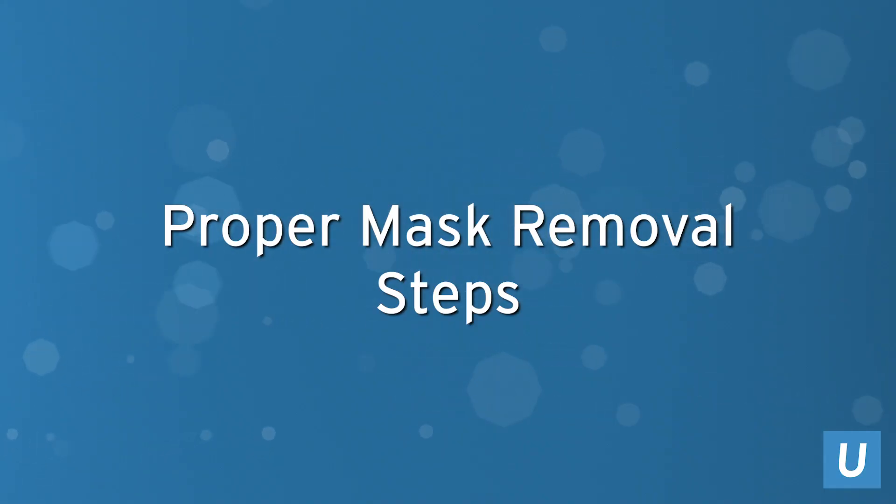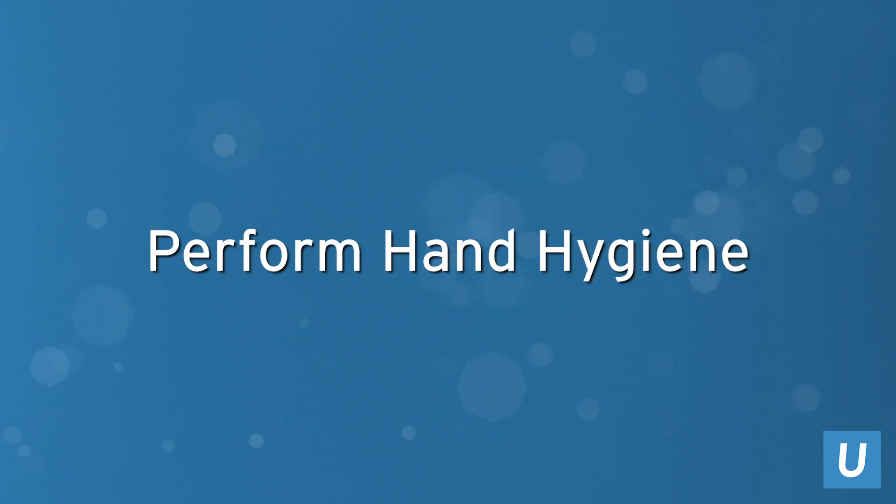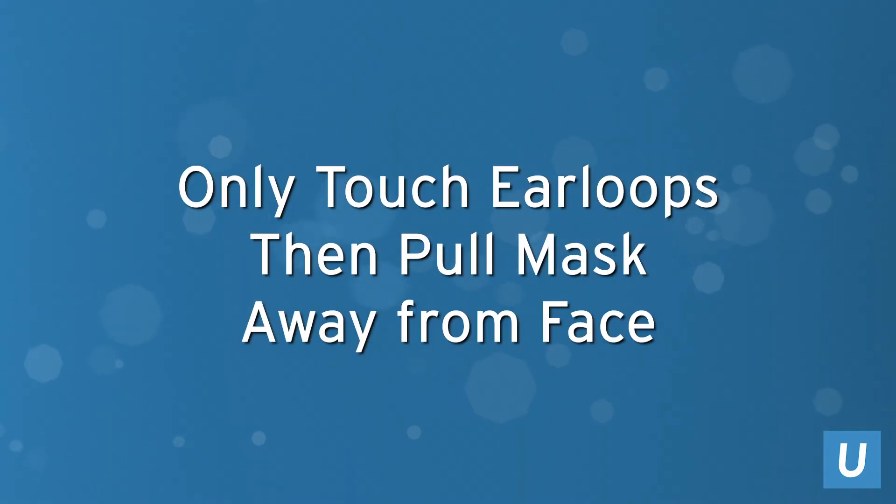If you need to remove your mask, you should completely remove it using the following steps. Perform hand hygiene first. Then, only touching the ear loops, pull the mask away from your face.